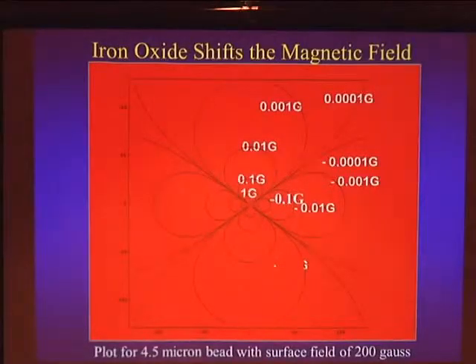Now, how are we going to see single cells? So I'm going to claim I'm seeing single cells. Don't be confused. This is not like the pictures you saw last night, where with 1 micron resolution, I could see a cell. I'm going to play a trick. I'm going to put enough MR contrast into the cell to make it look much bigger than it is. And the agent we're going to use is iron, any magnetic material. Iron oxide is the most popular.